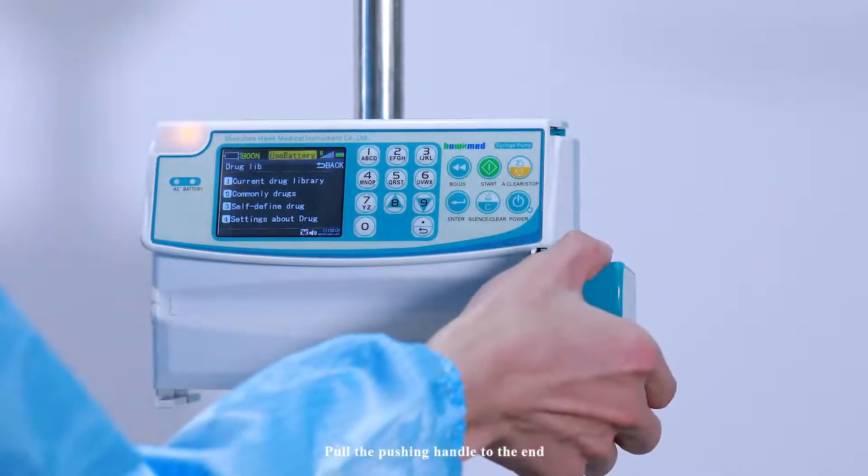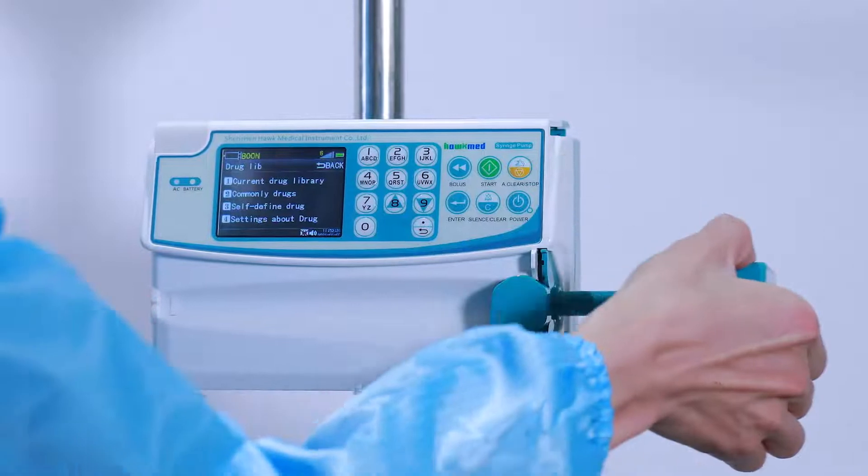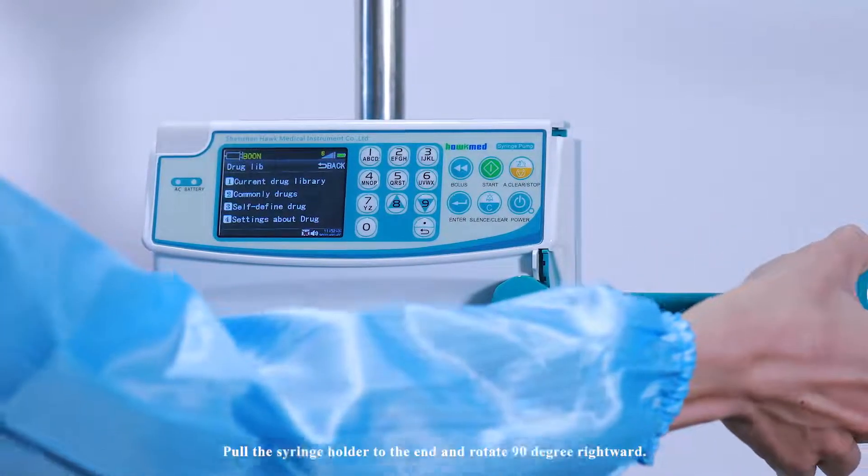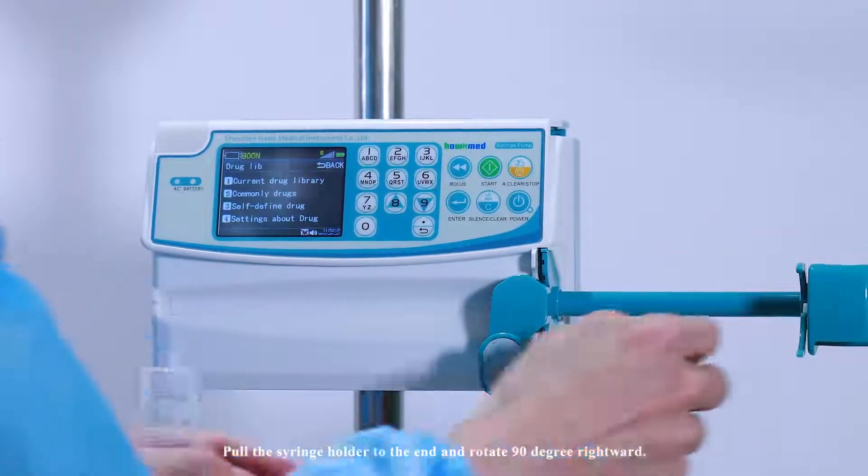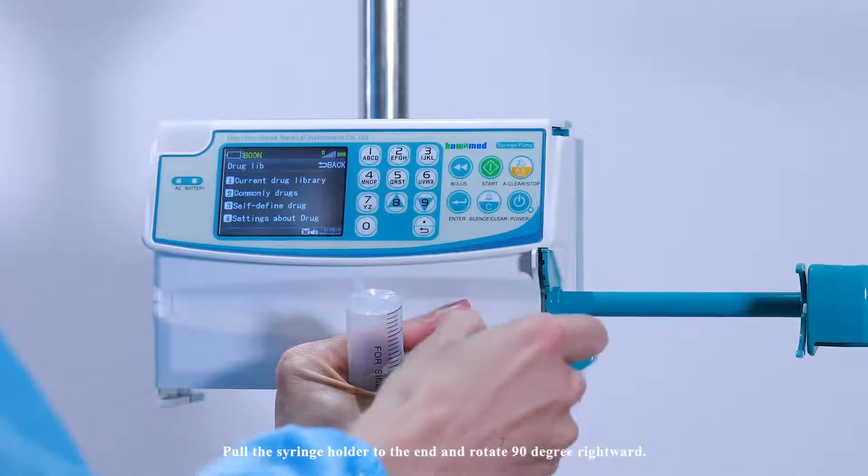Pull the pushing handle to the end. Pull the syringe holder to the end and rotate 90 degrees rightward.